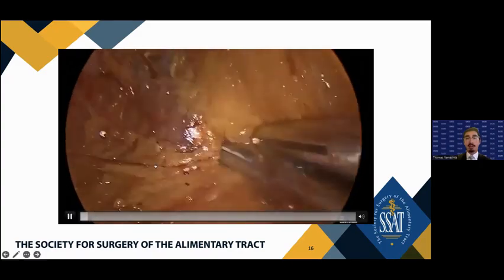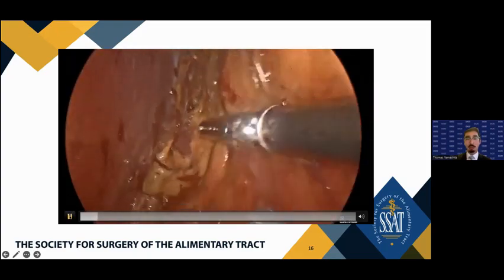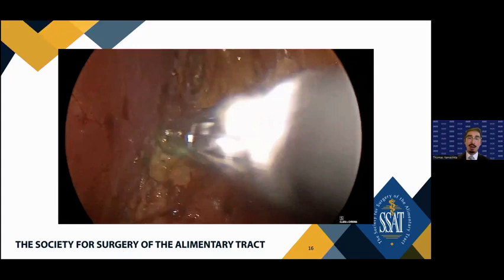And what you're seeing there is that the tumor is already in sight. This is a little bit of a different case because I've not done the full dissection that I do medial, lateral, and from the kidney, because I'm trying to disrupt as little as I can from the remnant adrenal to preserve it and decrease the risk of adrenal insufficiency. So in this one, I'm not going to try to find the vein to take it, but I'm going to try to find the tumor and take as little adrenal as I can without disrupting it.